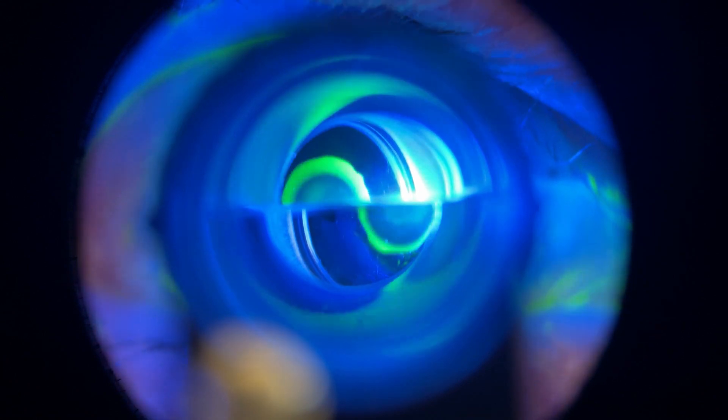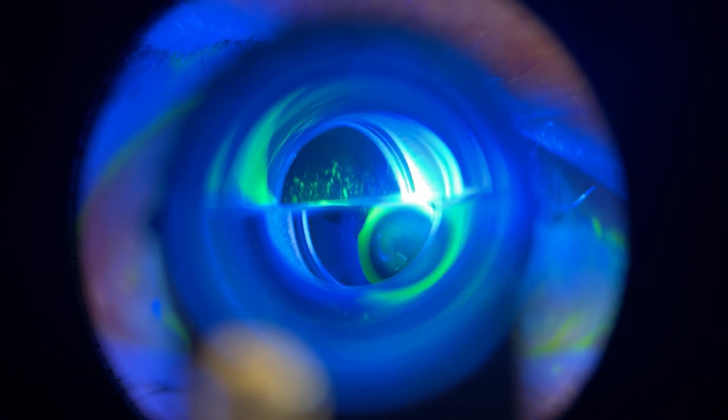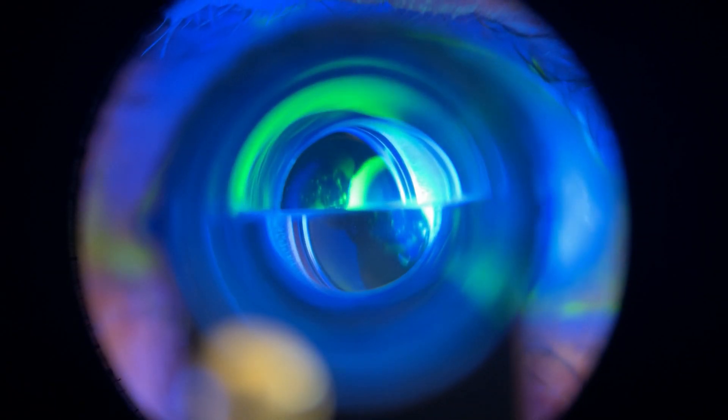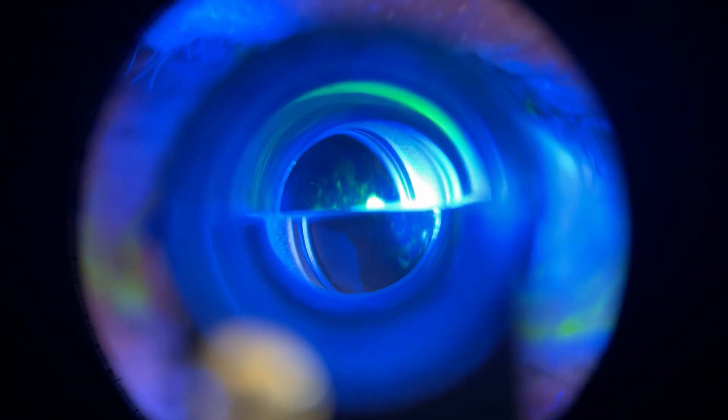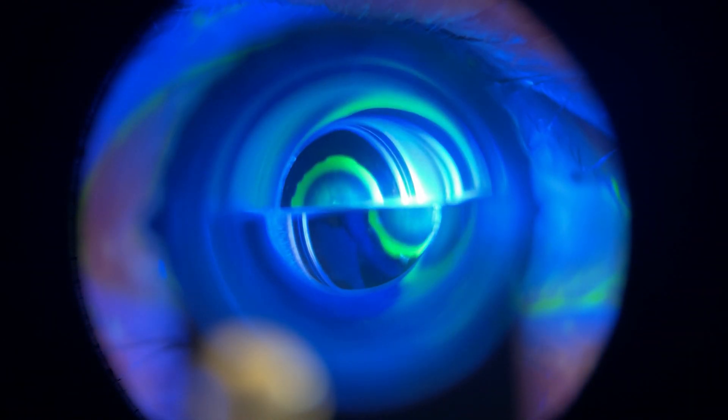Situation three: the two semi-circles do not have the same size. This means you're not in the center of the cornea. If the top one is bigger you have to go up; if the bottom one is bigger you have to go down. Situation four: your semi-circles are slightly off to the side and one of them is cut off. You have to move toward the side of the one that is cut off — but again, come off the cornea first, reposition, and then go back on.